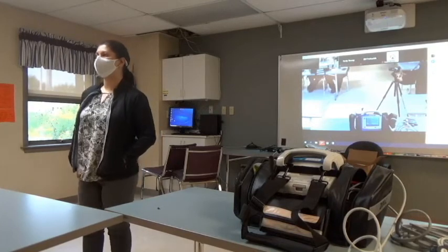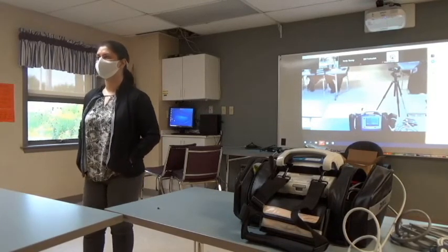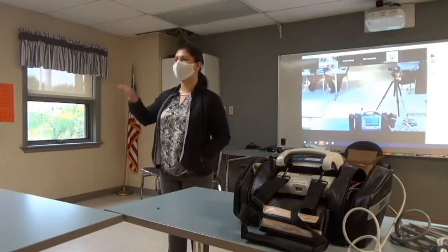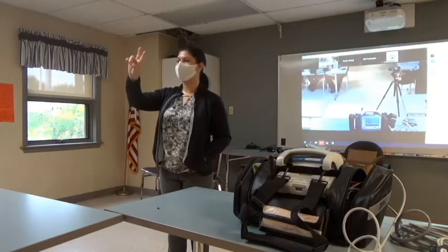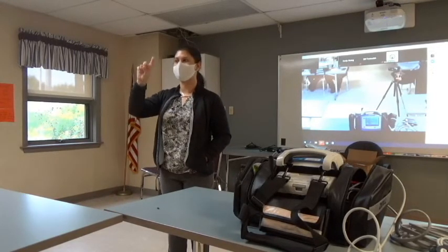The pacer button is a heads-up display. You're going to press the pacer button. The pacer goes up by 10, down by 5. It is a two-step process. The first step, turn the pacer on, so start pacing. Use your navigation keys to go to start pacer. That's step number one.